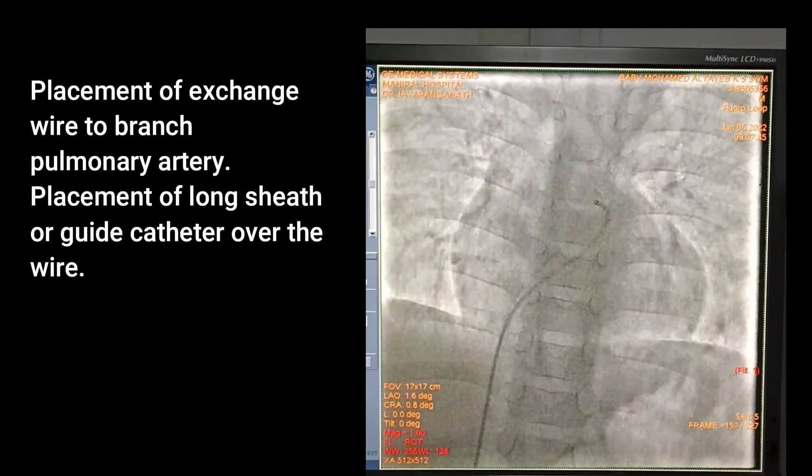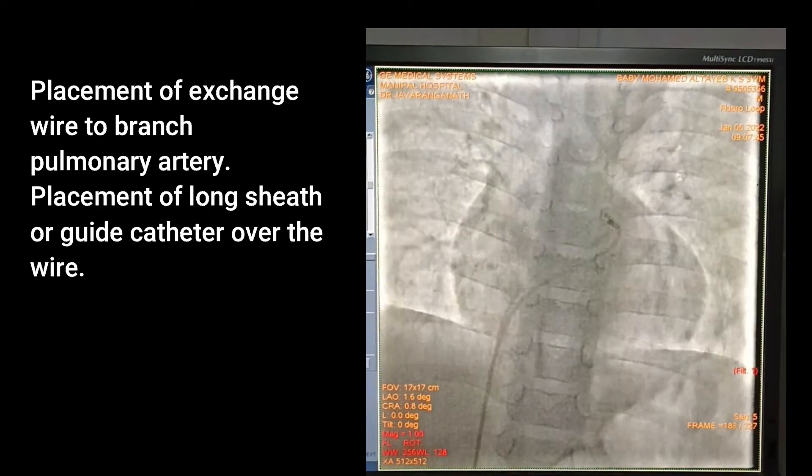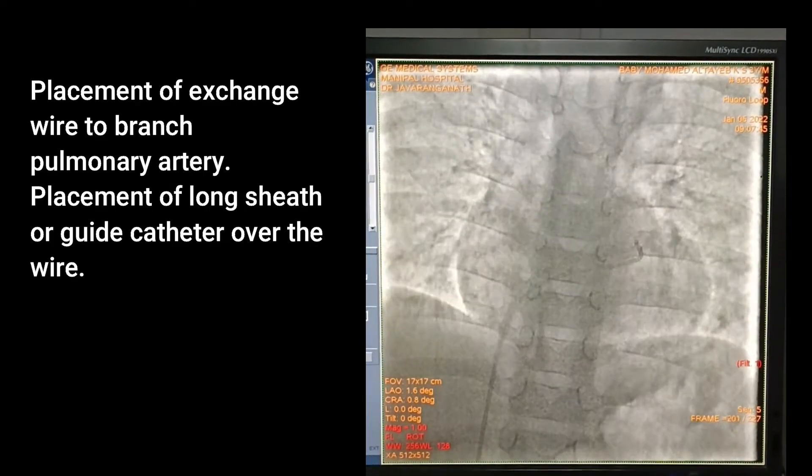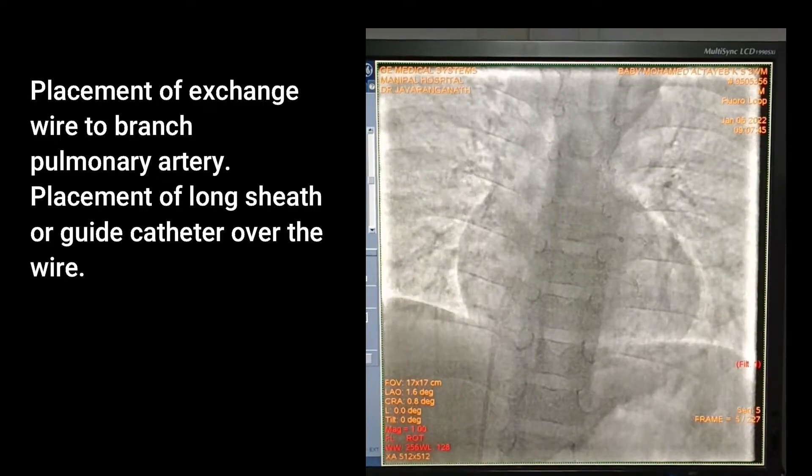Placement of exchange wire to branch pulmonary artery, followed by placement of long sheath or guide catheter over the wire.